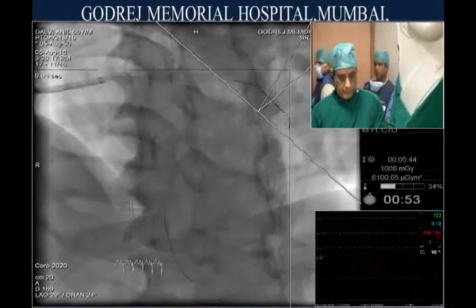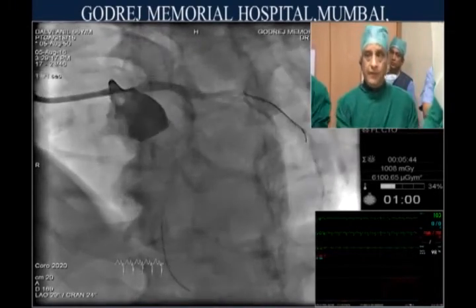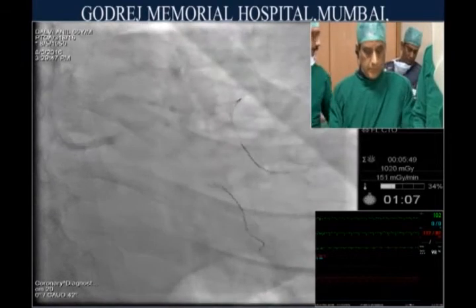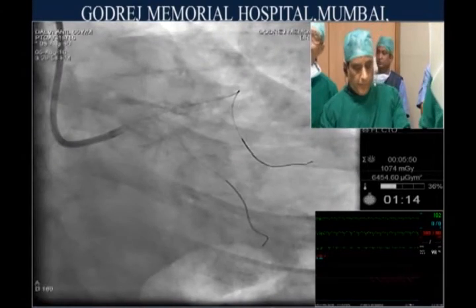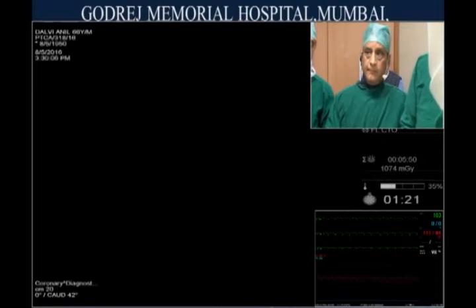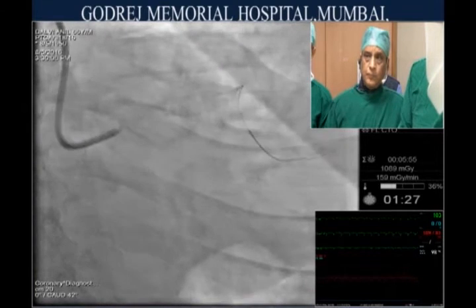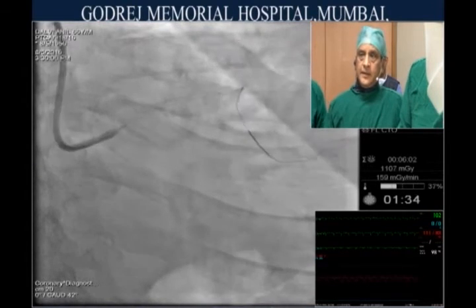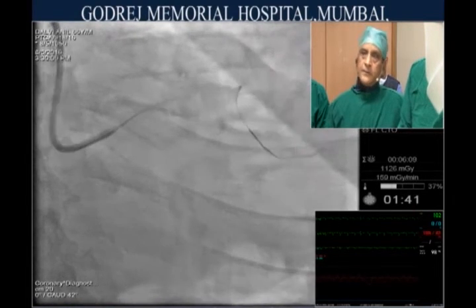Should we use a 4.5mm balloon for the ostium of the left main? We can use a single 4.5 balloon to proximally dilate, but let's see now. We'll take the wire out of the circumflex and then recross it. The circumflex looks good. The diagonal looks perfect — not even a 5 percent pinch. This is with the Biomimorph design.